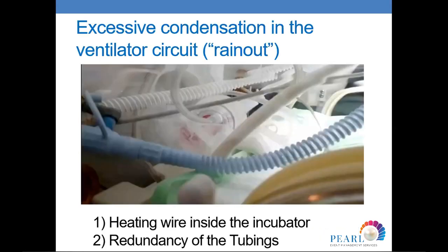So this is how it looked. I took it from our patient. There is water here. If it is video, you will see the water running here and there. Why I brought this picture: what can you see in this picture that is wrong? And this is just a teaching point, it led to increased rain-out.